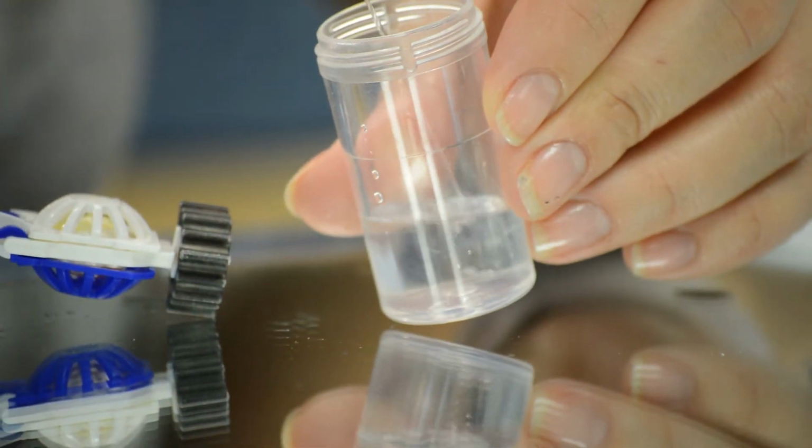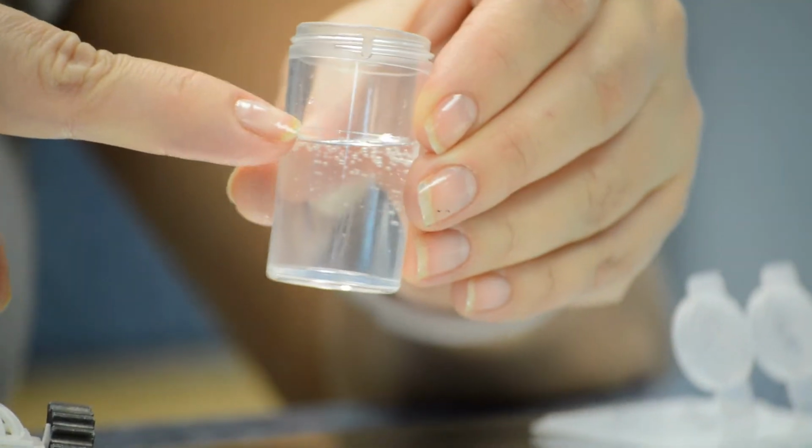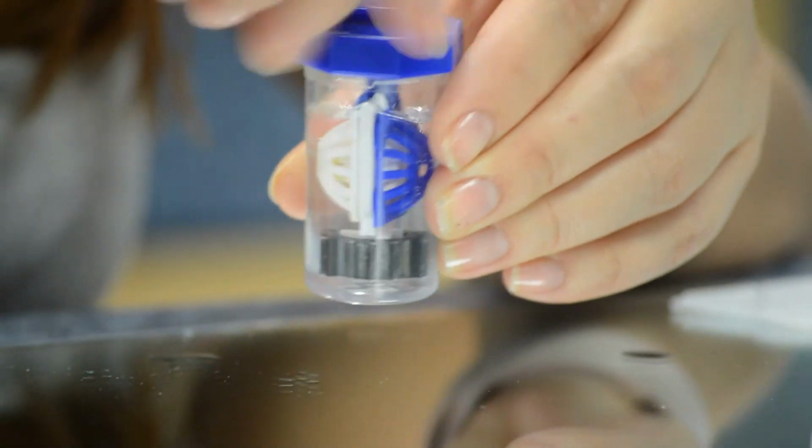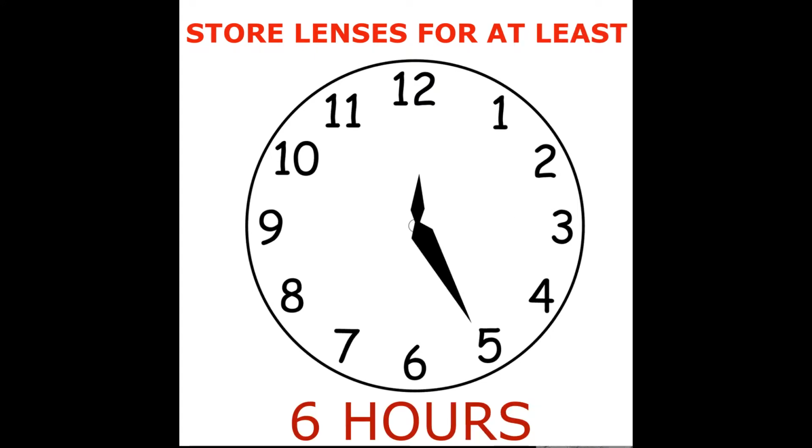Fill your container with the clear care solution up to the gray line. And place your Ortho-K lens case inside. Do not shake the container, but simply place it on a flat surface. Now let your lenses sit for at least 6 hours. Never insert your lenses before the 6 hours are up, or burning and stinging may occur.